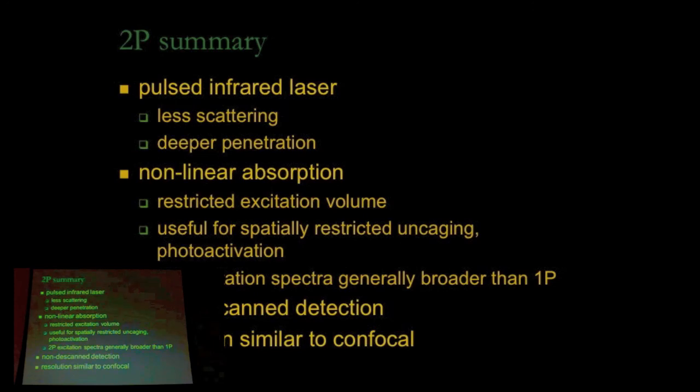But the longer wavelength should be better, as long as you don't accidentally hit the jog button on the motor that controls the mirror and go up to too much power and kill your mouse, which can happen. You should really put something over that jog button.